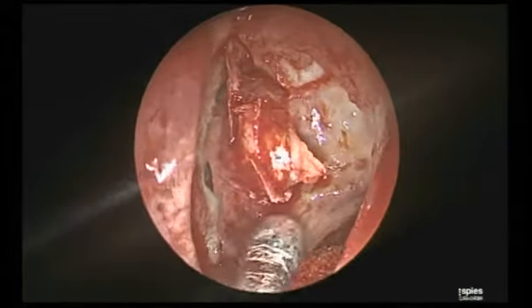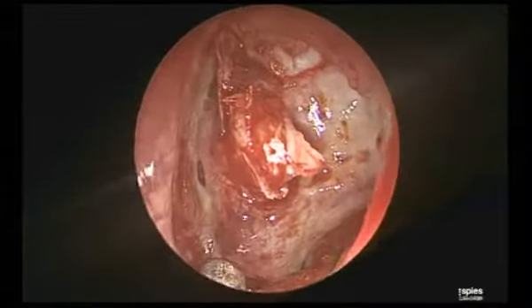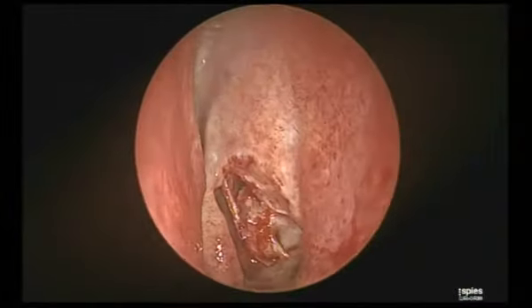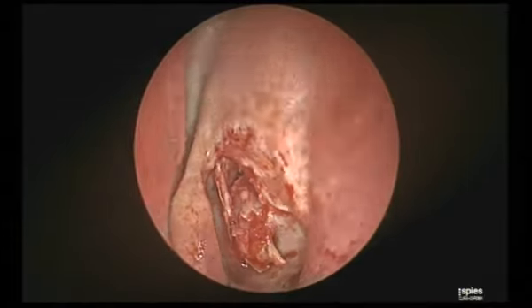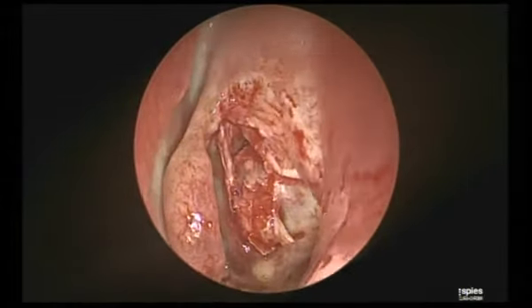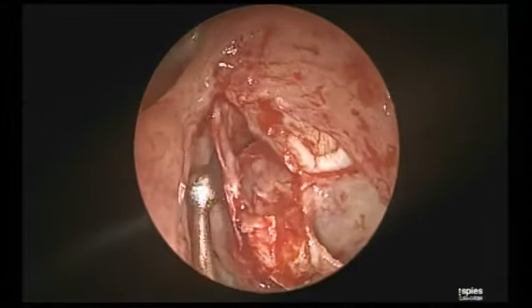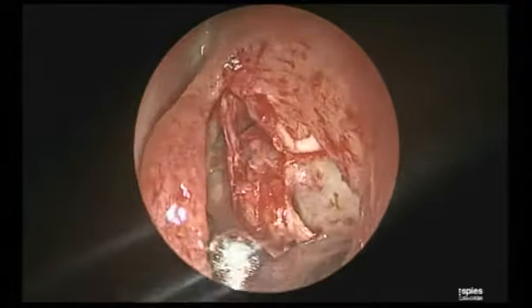See, over the period of time doing sinus surgery in the last 12 years, having done around 7,000 cases now, we have seen all kinds of failures and complications, which is unbelievable if I say. And we have overcome all those, and the technique we have developed, and in the last few years not seen a single complication, is the use of 70 degree. The hallmark of this technique is the use of 70 degree.